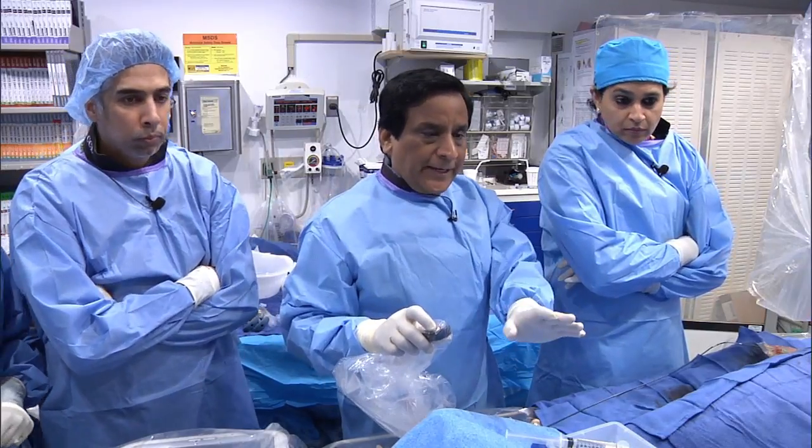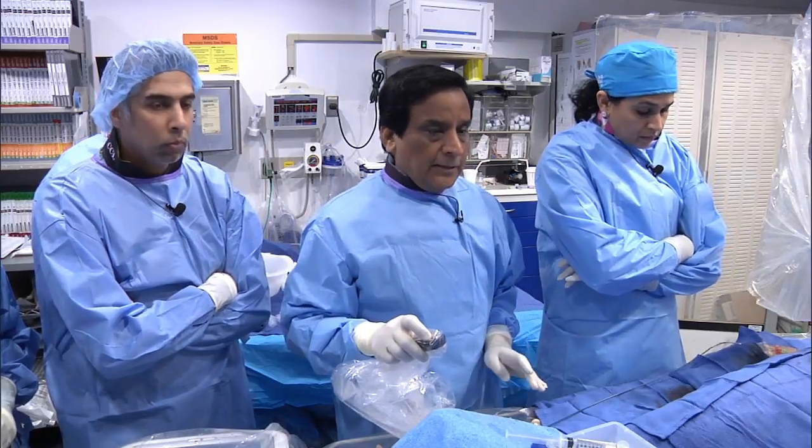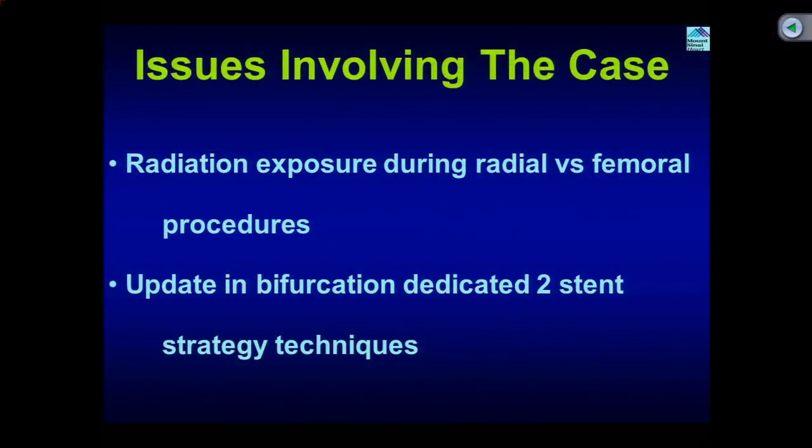With that note, before we go on to start the catheter, I will briefly talk about the radial, and then we'll continue live advancing the 7 French guide, because we always used to worry about putting a 7 French guide into the radial, but I think the overall data are there now. Yes, maybe a little more radial occlusion, but if it is a good size radial artery, particularly in a young male, you can use the 7 French guide.